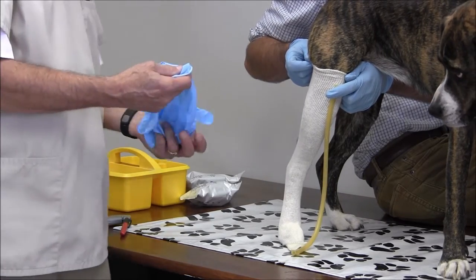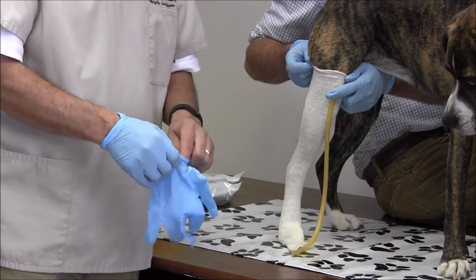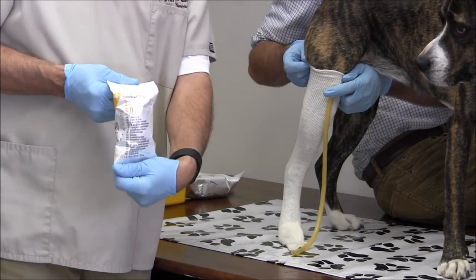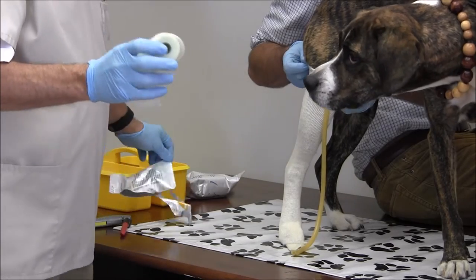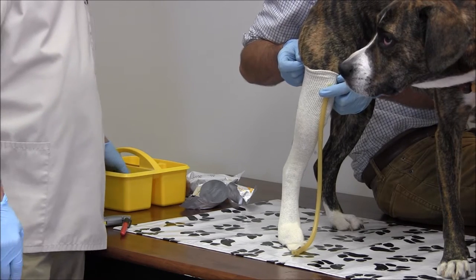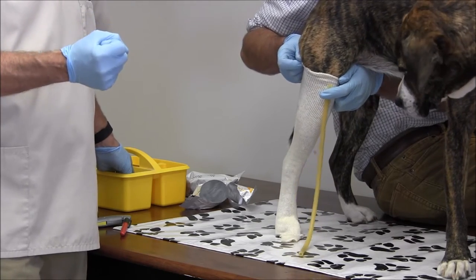We're going to go ahead and put on our gloves. We'll use two inch fiberglass casting tape. We're going to leave this in the water for ten seconds — just regular room temperature water is fine. After about ten seconds, we'll pull the fiberglass out and squeeze it three times to get the water out.